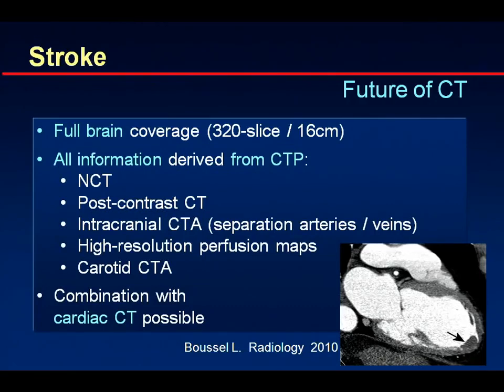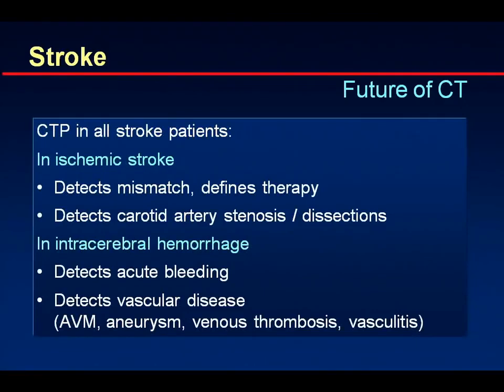When doing so, you'll quite frequently find potential causes for stroke. A group from France has shown a large number of patients that had either thrombi, open foramen ovale, or massive plaques in the aorta that could decide where the stroke came from. So you could do it in all stroke patients.